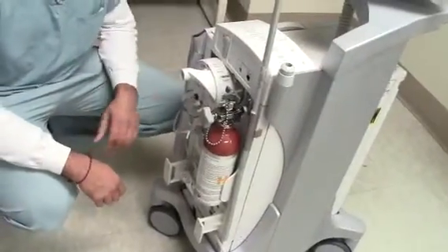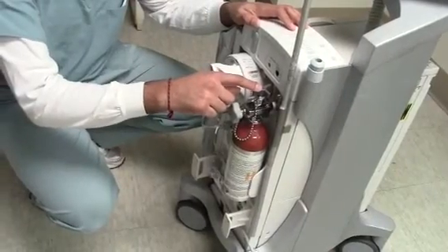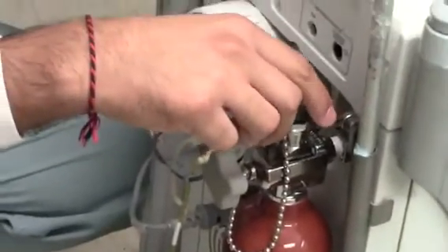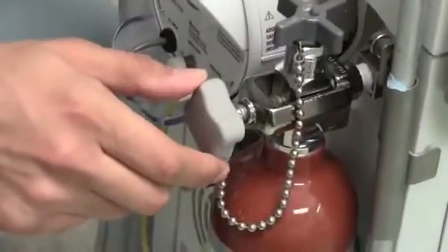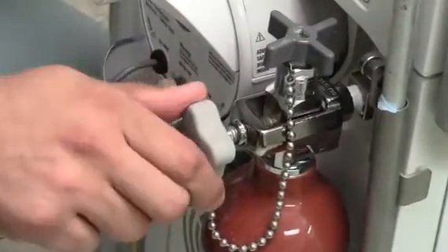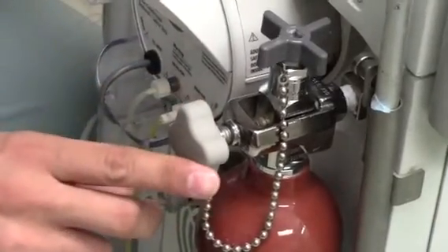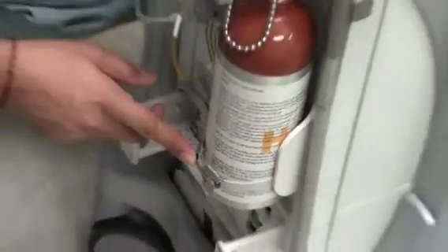Step one: you want to make sure the helium is off — to tighten it, you turn it to the right, so righty tighty. Step two: turn this knob to the left to loosen it, lefty loosey. Step three: take the holding latch off.